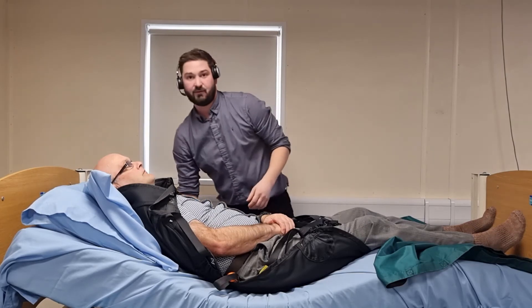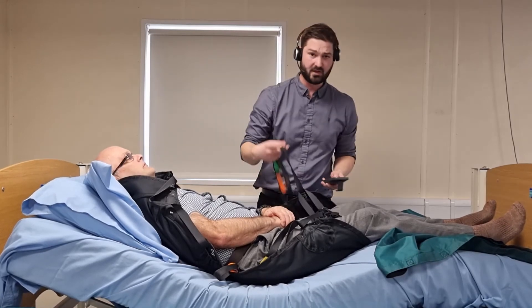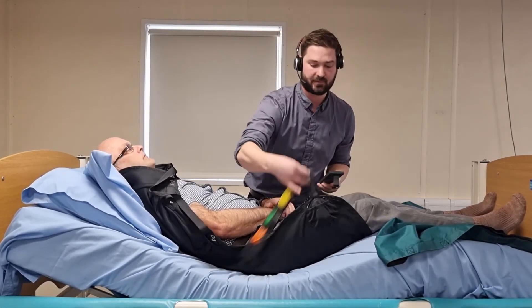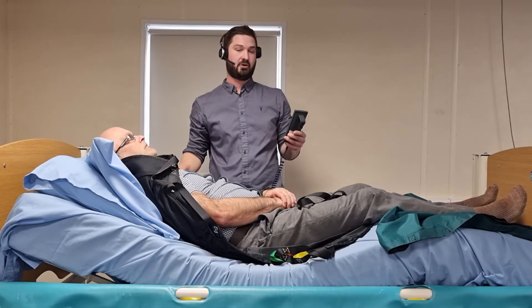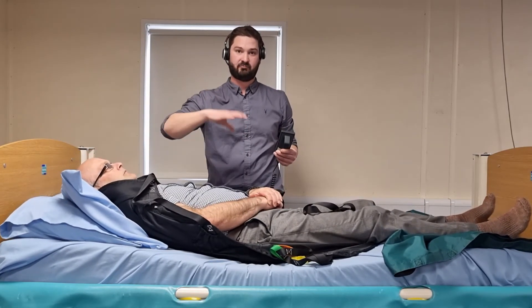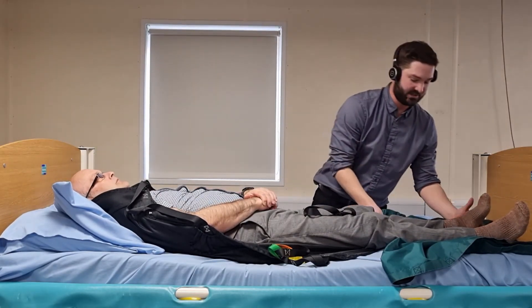Next I'm going to reprofile the bed, bringing it back up to a safe working height. While doing that, I'm going to undo the lower part of the sling and get it prepped and ready for taking off. Once we're in a good position, I'm going to unprofile the bed down as well so it facilitates the person rolling into side lying for the sling to be removed. I can now also take out the slide sheet.